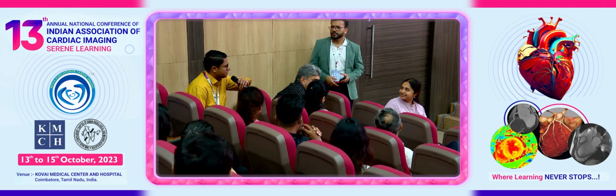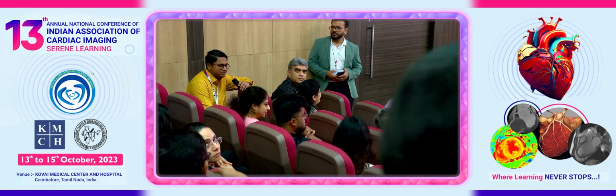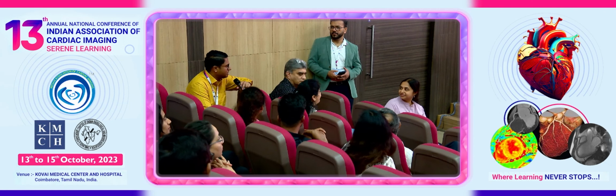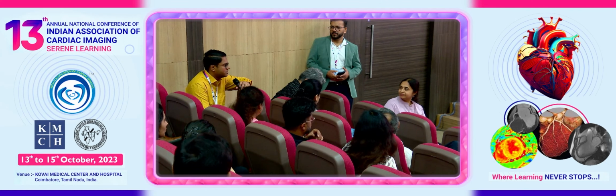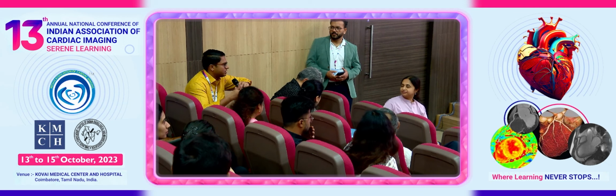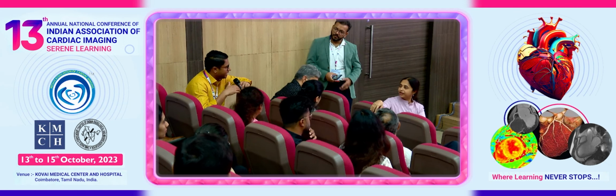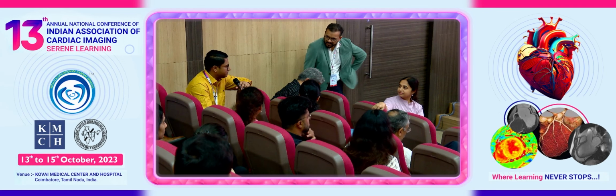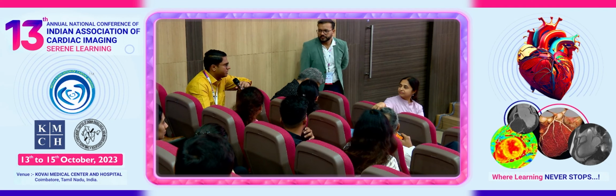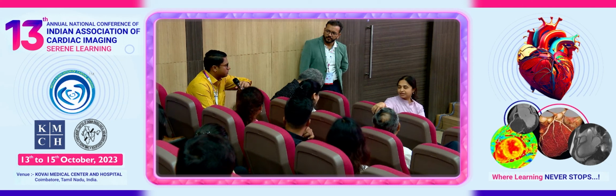They always discuss with us. Even before sending the case, I get a call saying that we are sending a case for TAVR evaluation. So I give a comprehensive report. It doesn't matter whether the CD is going to a company or not, I give my report with all the measurements and everything that is required for TAVR.